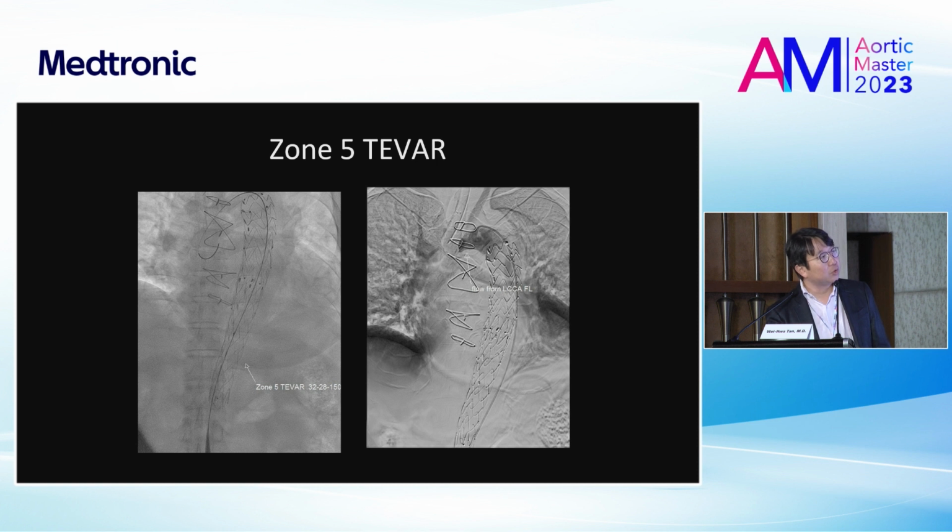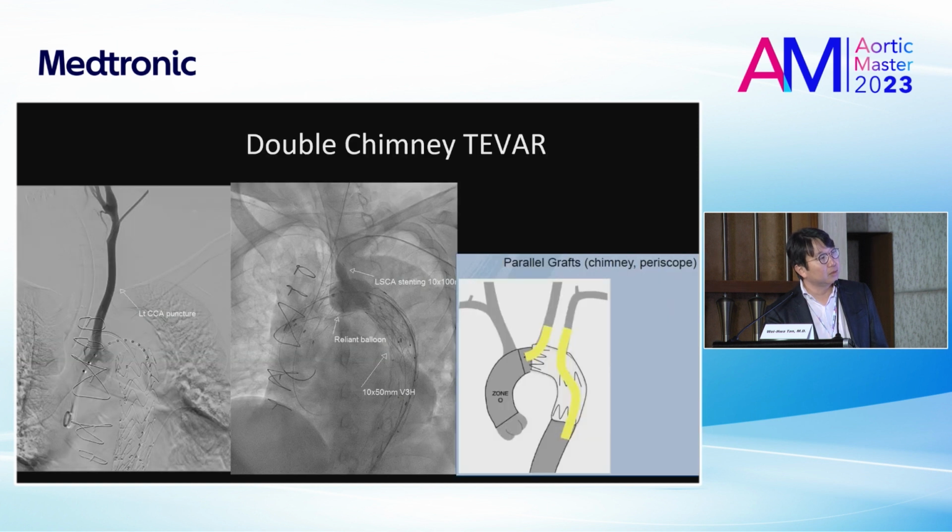The reason that we do the arch TAE is that we found that the supra aortic trunk of the patient was also supplied by the false lumen, and maybe will cause future dilatation of the false lumen. So not just treating the true lumen, we also try to do the obliteration of the false lumen.